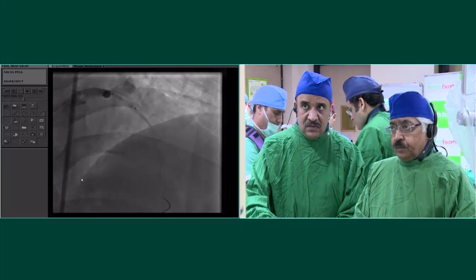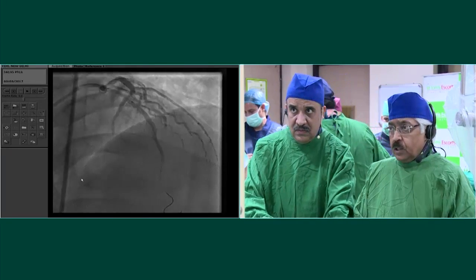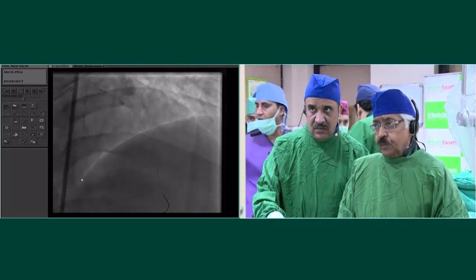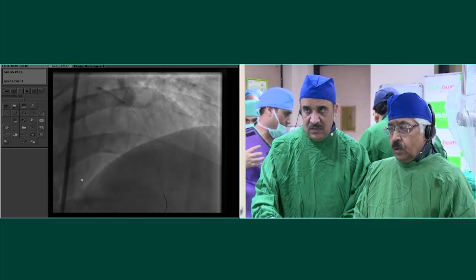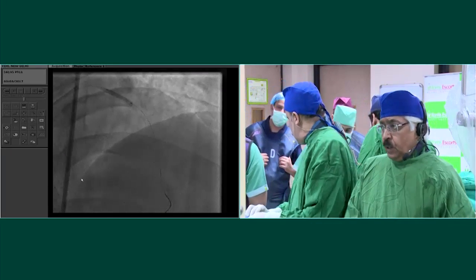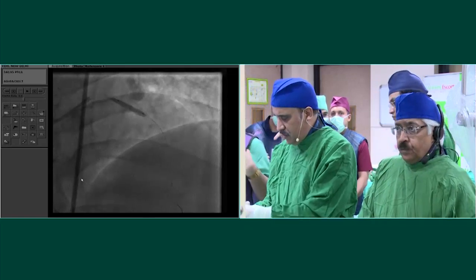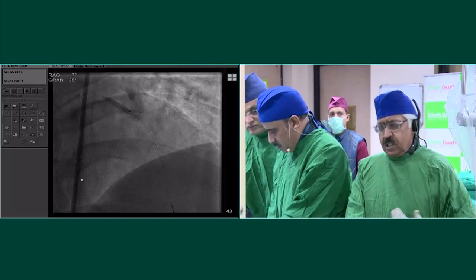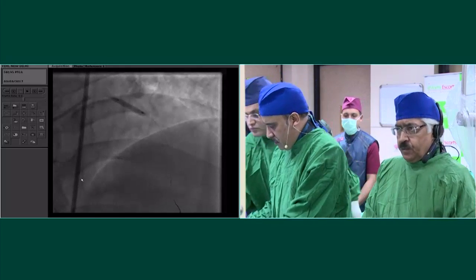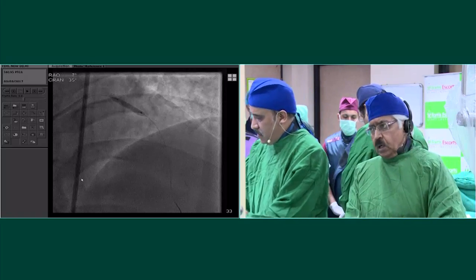Go up. Check that. Okay, let's go up. There's a side branch which comes off there, as you saw. Go up 2. Four. You see, and 6. That looks neatly open. These are soft lesions. 7. Okay, good. And deflate. Caudal. AP caudal.